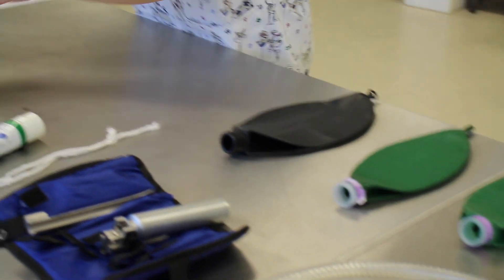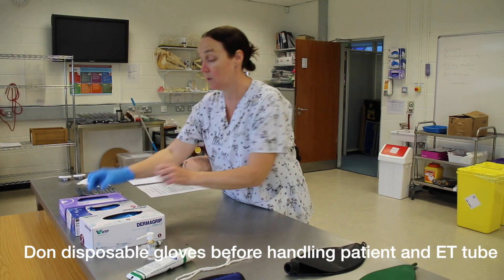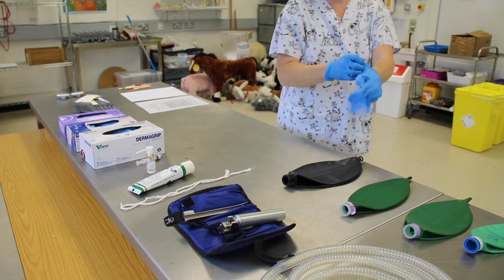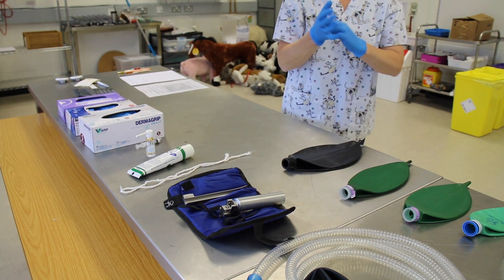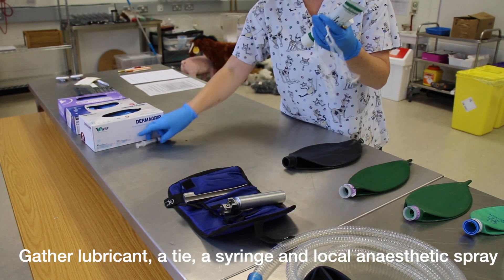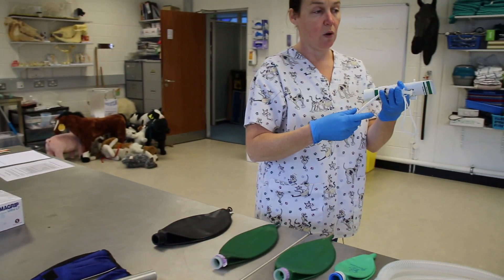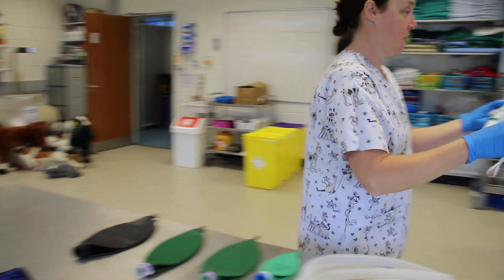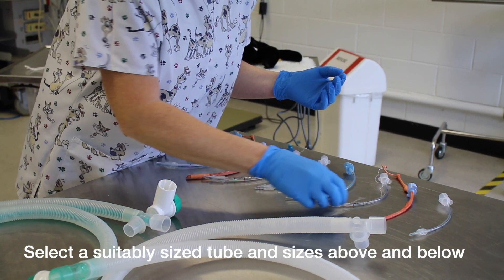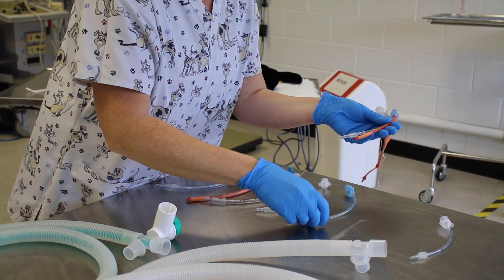Now we're going to collect our equipment. Put on the gloves. We need lubricant, local anesthetic, a syringe, and a tie to secure the ET tube in place. We always select three endotracheal tubes — the one we think should fit, which is 3.5 in this case, and we go with a 3 and a 4 as alternatives.